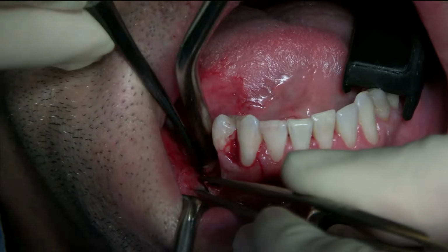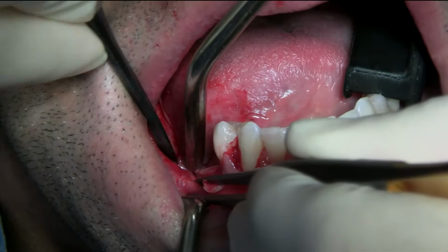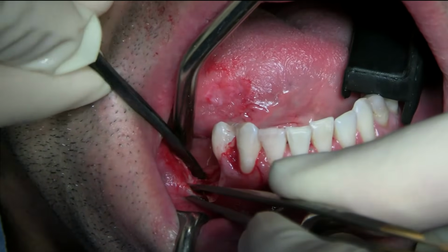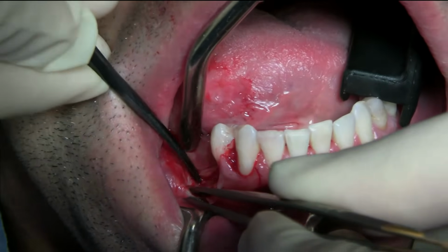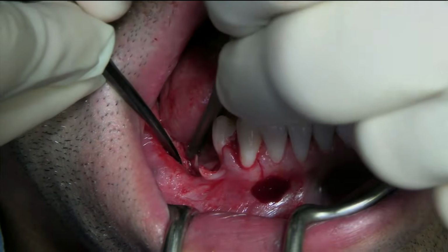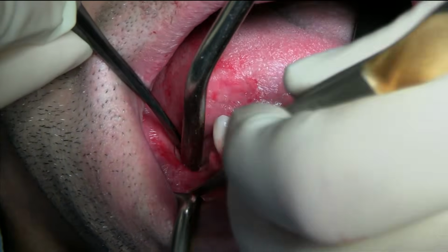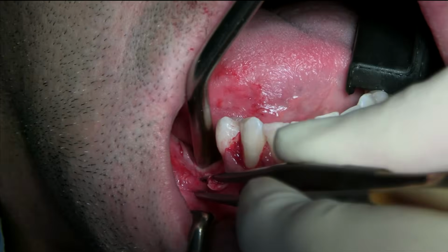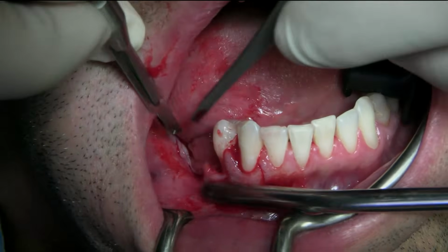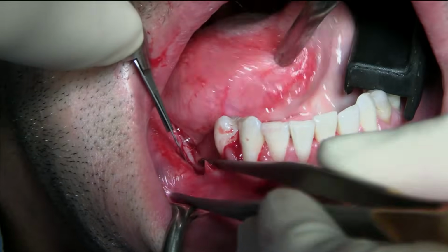Suction there. Okay, I need to cut it a little bit because the fibers are entering into the area where the old implant was. Suction there.